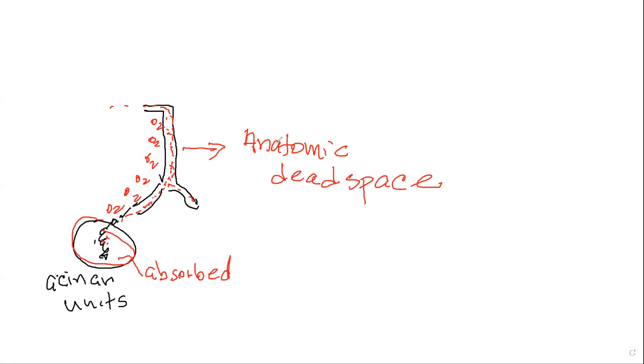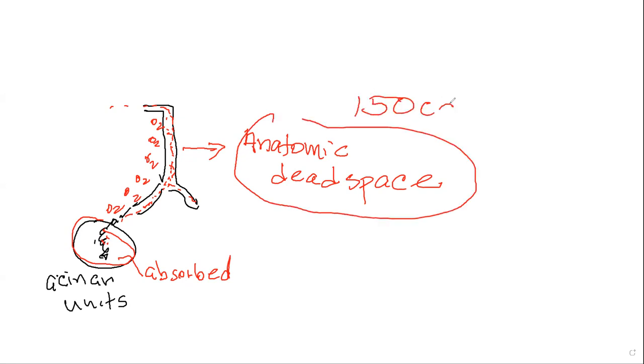And actually, this anatomic dead space contains 150 cc's or more of oxygen. So whenever you breathe out, 150 cc's of oxygen is going to be exhaled. So wouldn't it be nice if we save this oxygen? That exactly is the purpose of a device known as your oxygen reservoir devices.